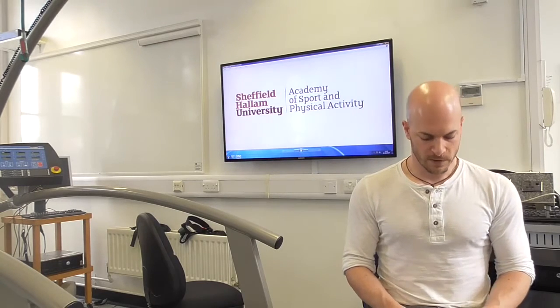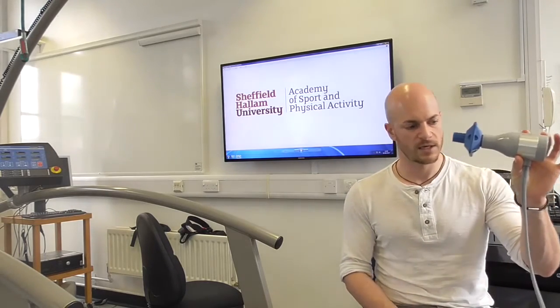Both of these things are assessed with this one maneuver. You're going to be breathing in and out of a mouthpiece that will look something like this, connected to some respiratory equipment. You're also going to be wearing a nose clip. Pop the mouthpiece in — this will be a clean sterilized mouthpiece — and make a nice tight seal around it. Then take three or four nice relaxed resting breaths, just as if you were sitting at home watching television.